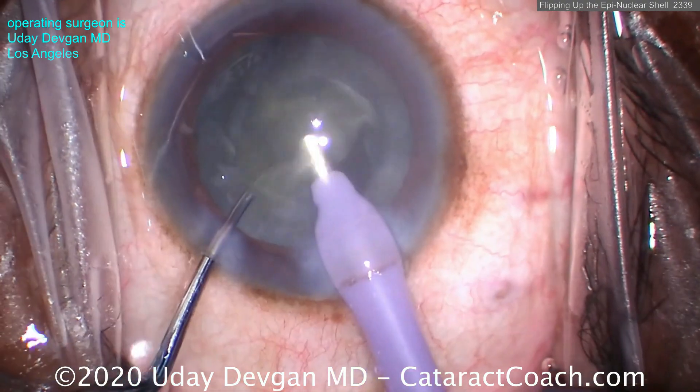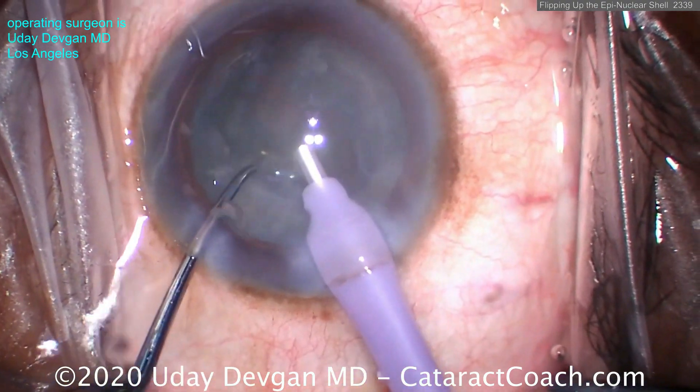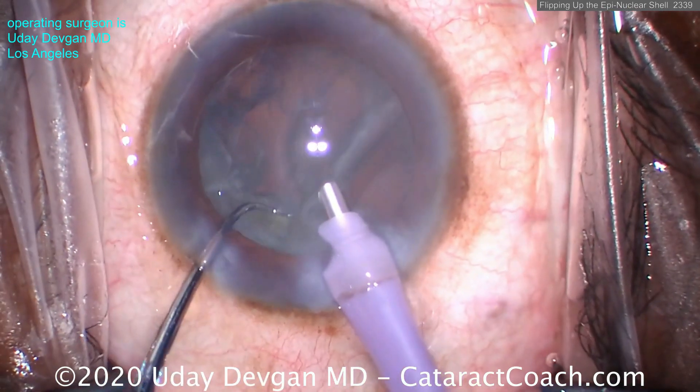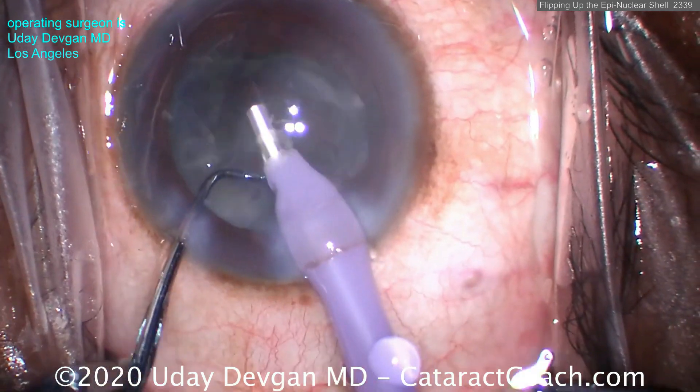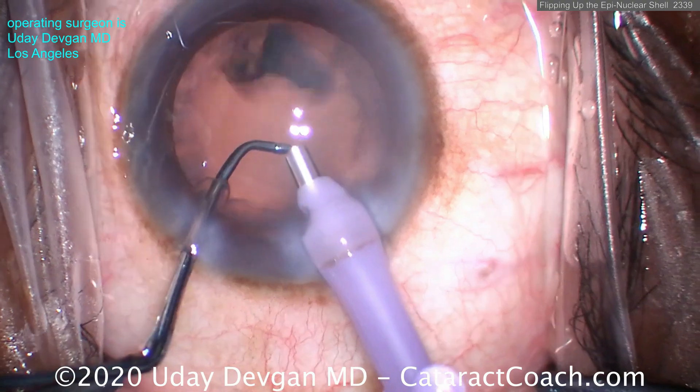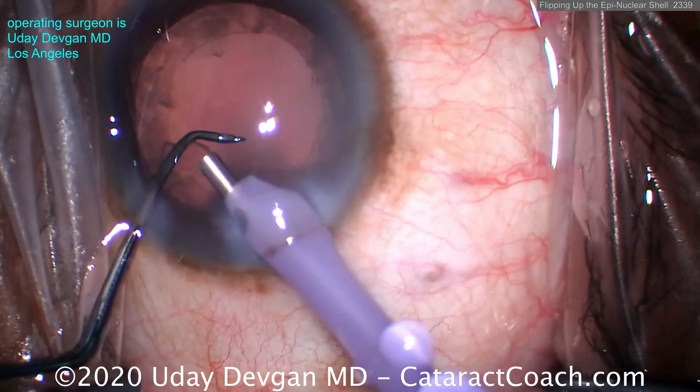Here's one more time in real time — check this out. Vacuum, vacuum, vacuum — those pieces come down. There's a big epinuclear shell. Now again, grabbing it — as soon as you grab it, push with the chopper: push, push, push, grab and push and flip it over. That's the epinuclear flip technique — works so beautifully.